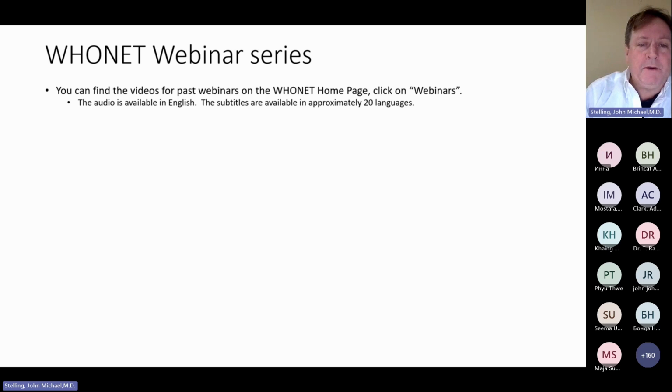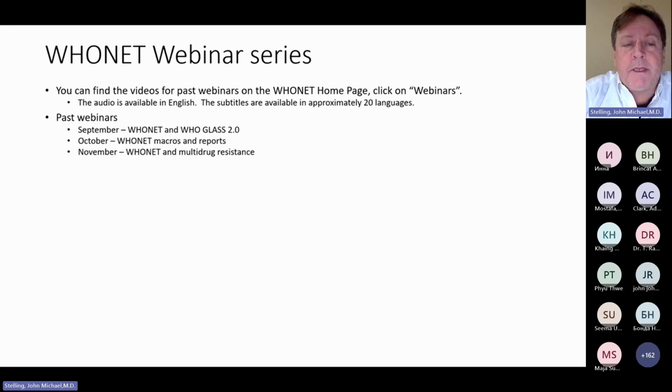So the WHONET webinar series. You can find the videos for the past webinars on the WHONET homepage if you click on webinars. The audio is available in English. The subtitles are available in approximately 20 languages. These are the topics that we have had so far: WHONET and WHO GLASS, WHONET macros and reports, WHONET and multidrug resistance, multidrug resistance profiles.